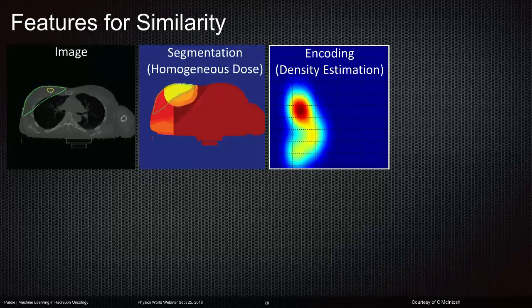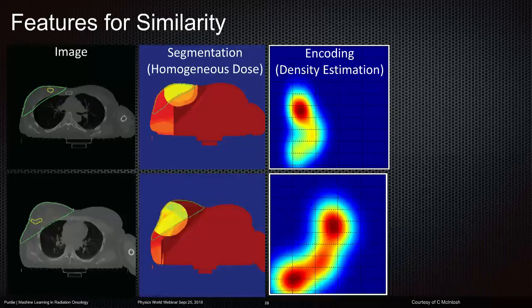We could take a look at the end leaf from the forest, and we can start coloring an image, for example. Each color here would represent a different leaf, representing a different dose. Based on an image similar to this, if we took a look at two features, shown in the right-hand image, and we're trying to relate how these features are able to predict dose for a patient, or which features are important for predicting dose, then we can generate this density encoding as an example. Now, that's for one patient.